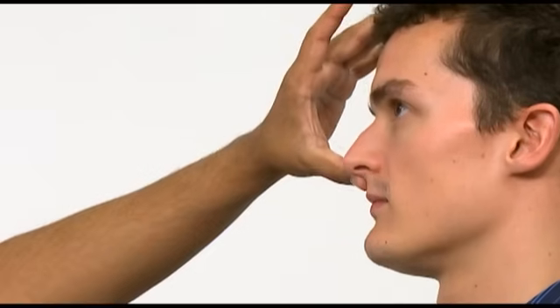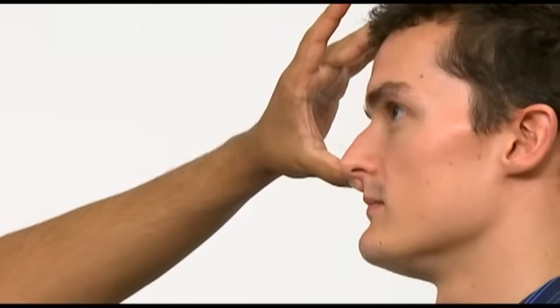After this, you can check the patency of each nostril by covering each nostril in turn with your thumb and asking the patient to sniff in. Can you sniff in for me please? And relax. And again for me please. And relax.